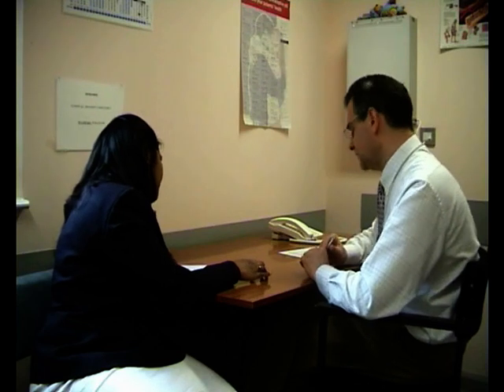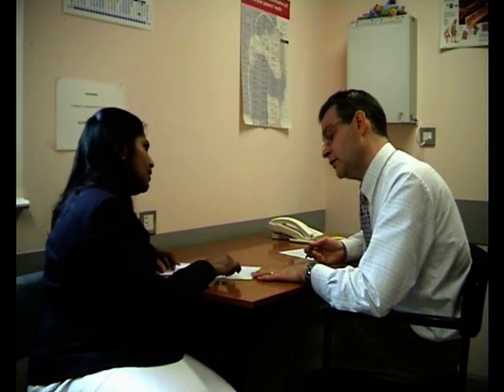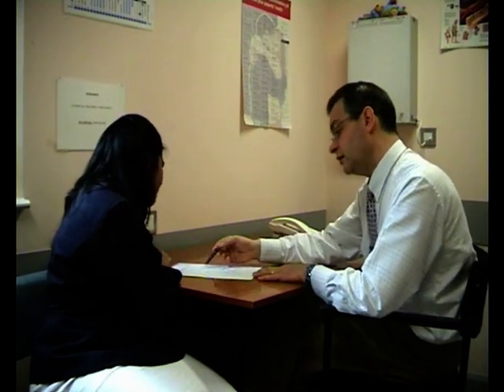Okay, that's good. So could you give me a few-word summary of the key features of this test? It's a urodynamic study showing a normal flow, normal voiding pattern, no demonstrable stress incontinence, and suggestive of detrusor instability. Okay, we'll get to what the possible causes might be in a minute, but as you say, this has shown an abnormal rise in pressure during filling.